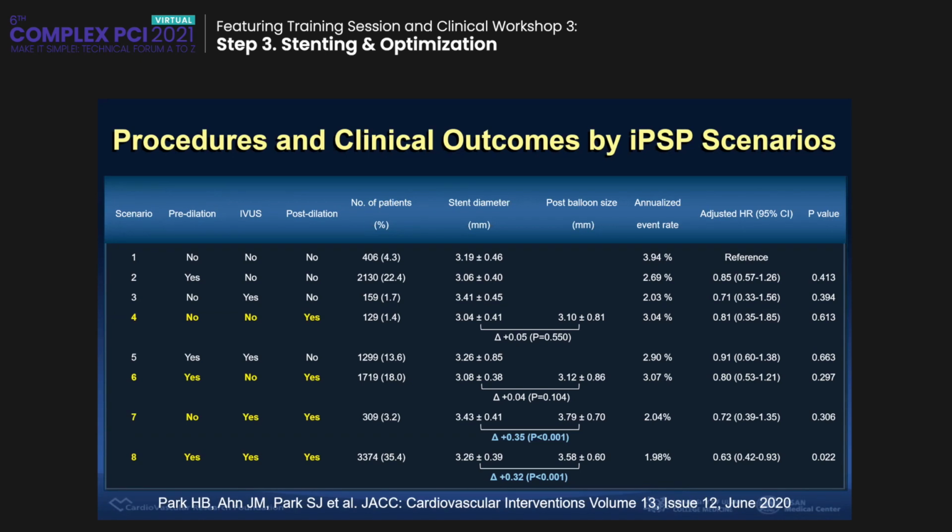What I mean is that interventionists who do not use imaging do the post-dilation, but actually do not achieve a greater MLD. We have to emphasize using imaging in every PCI case.